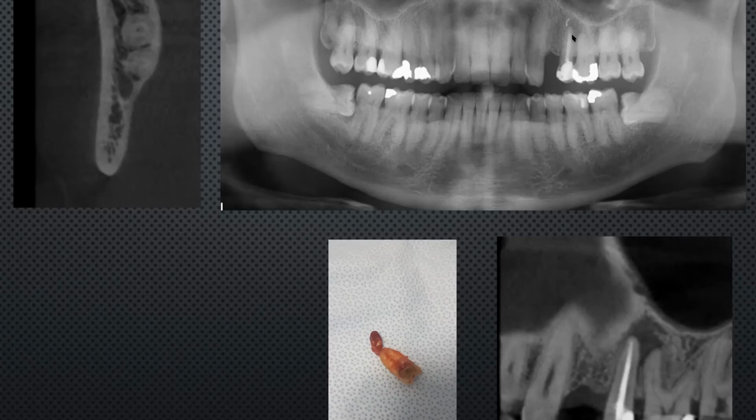It really depends on the soft tissues. It depends on the thickness, the contour. If the contour is perfect, as though the tooth can literally just fit in and it's sitting beautifully, then I would consider a punch. But more often than not, that's not the case. And you have to consider doing a little bit more soft tissue work at the time, which would be borrowing keratinized tissue from the palate, for example. So that's another opportunity to augment your buccal tissues. So I would just make a little incision and bring the tissues across. No excessive stripping. You don't particularly need relieving incisions at that point, but just enough to be able to see your cover screw, remove it, and then place a healing abutment without trapping any tissue under the healing abutment as you're placing it.